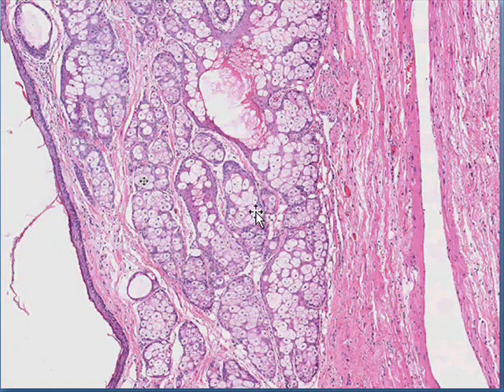Here's another picture in which we can now clearly identify that these are sebaceous glands. They look like classical sebaceous glands. You can see a squamous lining here at the edge of the cyst, and you can see some type of connective tissue here, perhaps with a large blood vessel. Here's some smaller blood vessels.